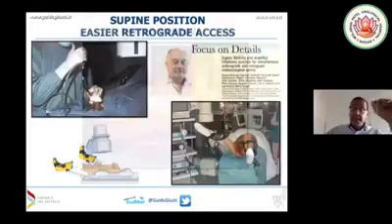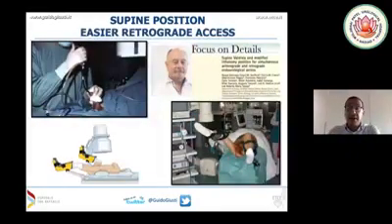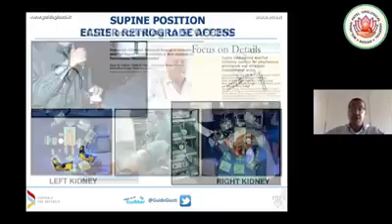Keeping this in mind, this other gentleman from Spain, Gaspar Ibarluzea, was the first to have the intuition to manipulate the patient in both ways together, PCNL and flexible ureteroscopy. And he invented this position. The name is the Galdakao position, because at that time Dr. Ibarluzea was working in Galdakao Hospital in Bilbao. Basically, the position is the same, only the legs are put in the stirrups, so there is another place for a second surgeon to perform a simultaneous flexible ureteroscopy.